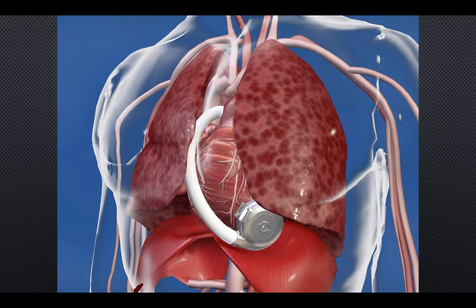Evaluation of patients with LVADs should be somewhat systematic. Assess how well they are perfusing by their mental status and capillary refill. LVAD patients are dependent on preload, so most of them will be fluid responsive. Heart rate can be assessed with an EKG, as auscultation is made difficult by pump noise. Generally, the LVAD does not interfere with the heart's underlying rhythm on EKG.